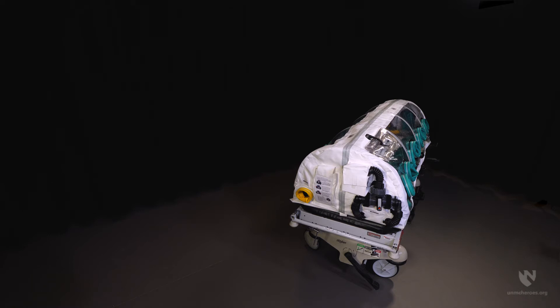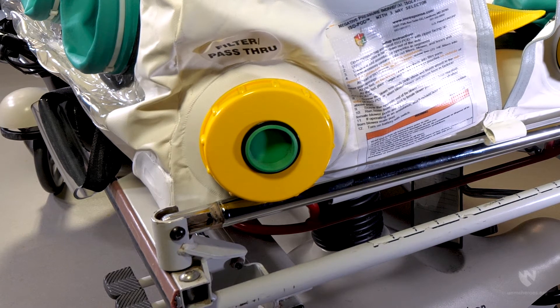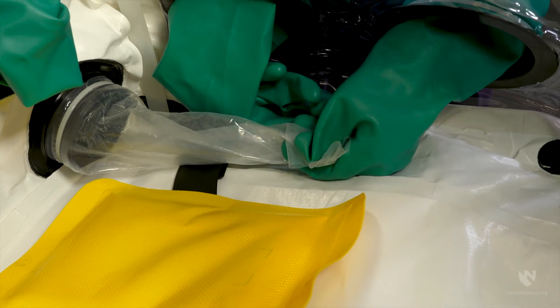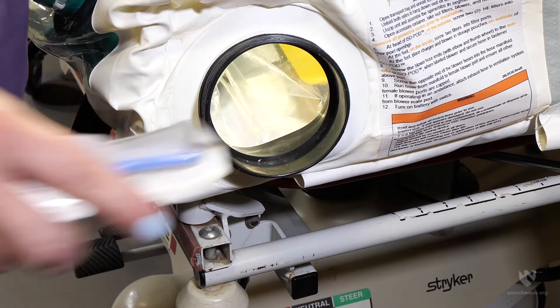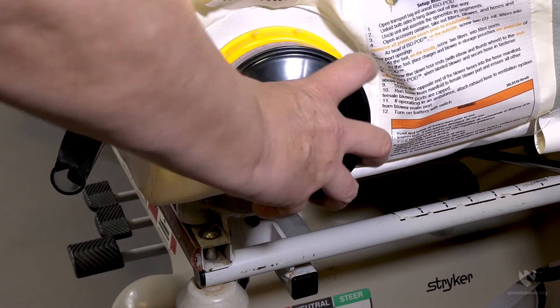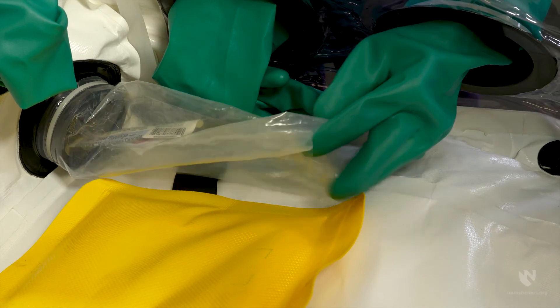On route, however, first responders or healthcare providers may need to add medications or other patient care items to the isopod environment. Pass-through ports were designed for this purpose and are located at the head of the enclosure. To access the port, the user must grasp the internal plastic sleeve using the glove port closest to the head of the bed, close off the plastic sleeve, and remove the exterior pass-through cap and filter. Items can then be placed into the plastic sleeve and the cap and filter replaced. The interior plastic sleeve can then be released and the items retrieved using the same glove port.